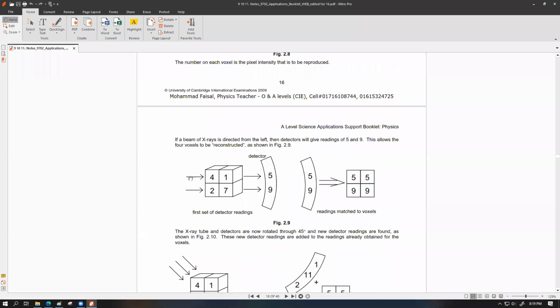So this will divide the entire patient's body into sections, which is going to lead up to these 2 numbers, because whenever I send X-ray beams through this from this direction, the X-ray beam would be simultaneously absorbed by this tissue part, 4, and it will also be absorbed by this tissue part as well. Together, they will make a total absorption of value 5.